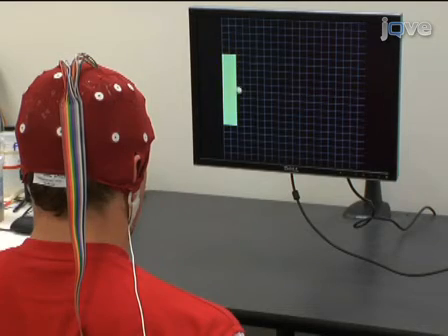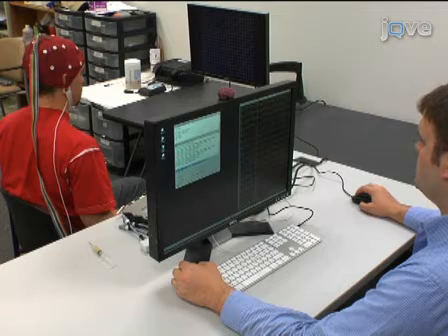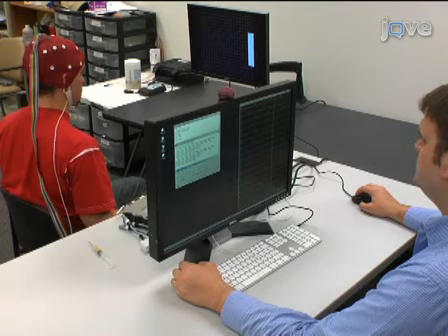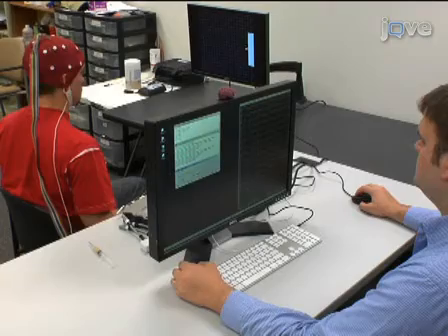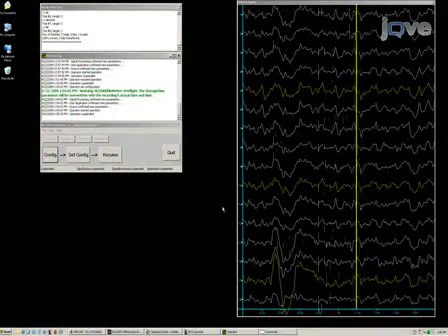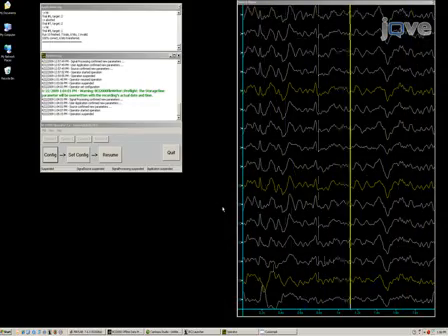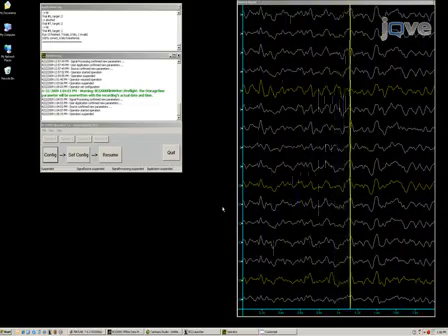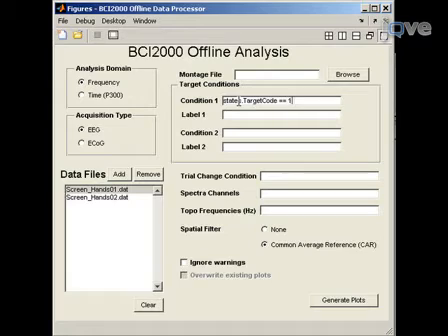After 20 trials, BCI 2000 enters a suspended state. During this time, you may need to readjust some of the settings if the subject is unable to move the cursor. If after four runs the subject still cannot move the cursor, you may need to reanalyse the collected data in the BCI 2000 offline analysis tool. Select the new channels and frequencies based on the new feature plots. It may take several runs or possibly several sessions before a subject can become proficient at the task.